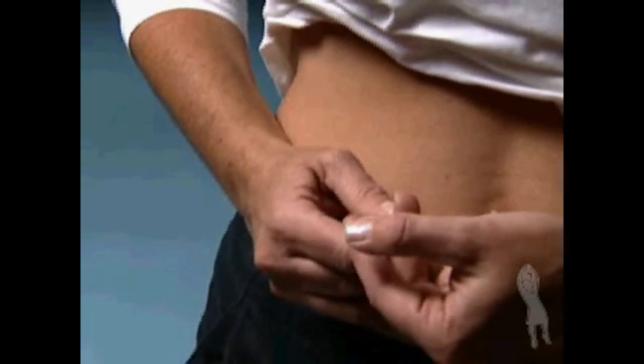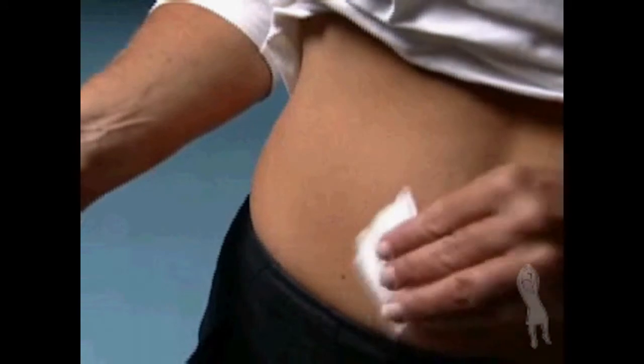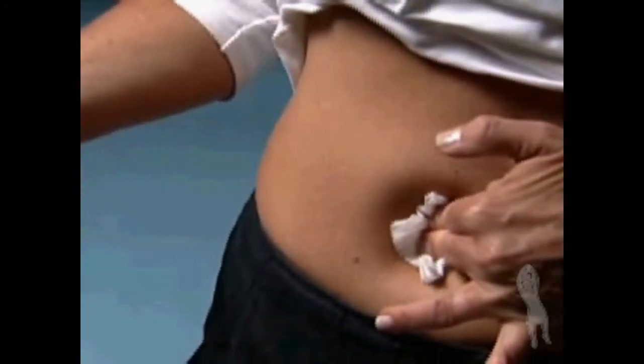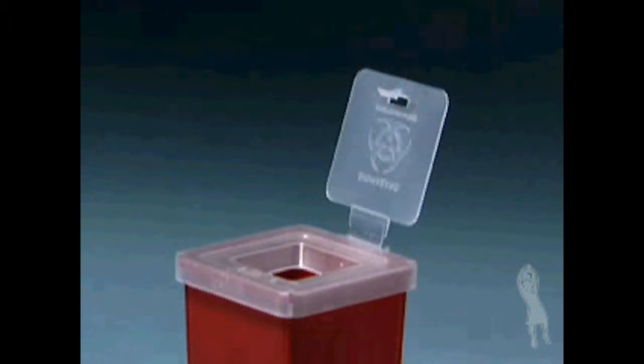Once the needle is inserted, you may release the pinched skin and push the plunger in a slow steady motion until all the medication is injected. Gently withdraw the needle and apply pressure to the injection site with a sterile gauze pad. Discard the used syringe and needle in your safety container.